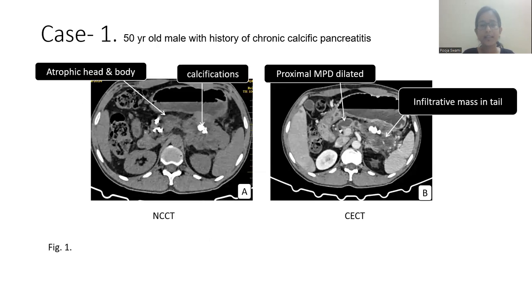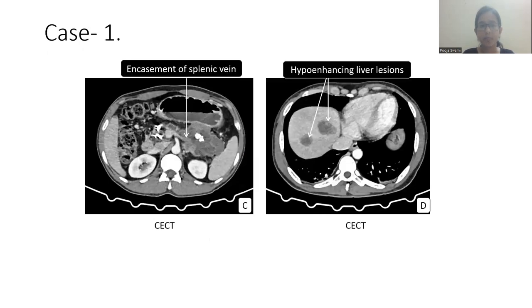Now we will start with the case series. Case 1: a 50-year-old male with a history of chronic calcific pancreatitis. Here we can see the atrophied head and body of the pancreas, an infiltrative mass in the tail region with calcification, and a dilated proximal pancreatic duct. Encasement of the splenic vein is also present.